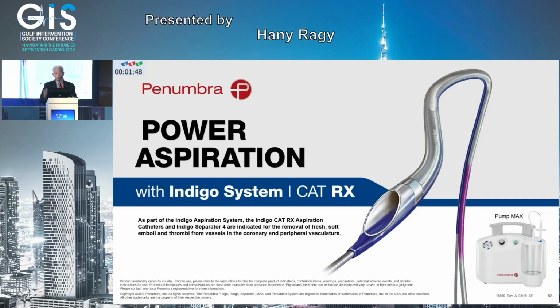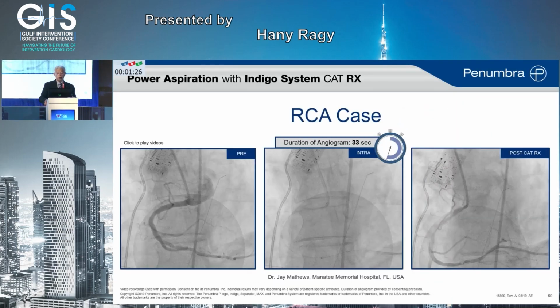Of course, one of the new tools that we have been recently using, both Sharif and I in the same cath lab, is aspiration. Now we have power aspiration using the CAT available to us in Egypt, and some of those ectatic patients, especially with the RCA, are horrendous, and we aspirate using the pump, and it has given us pretty decent results.